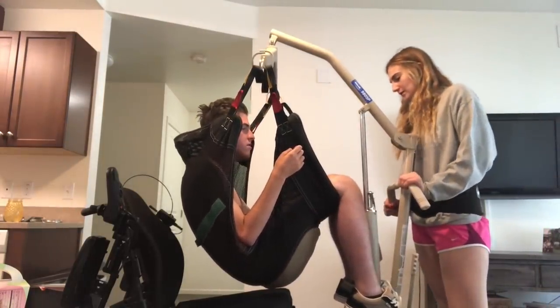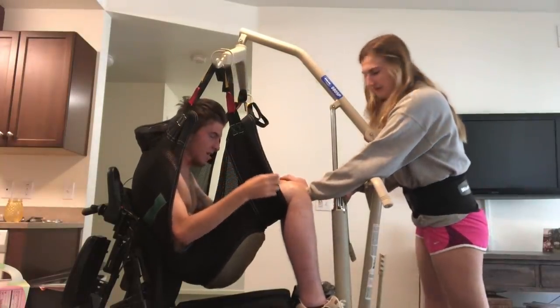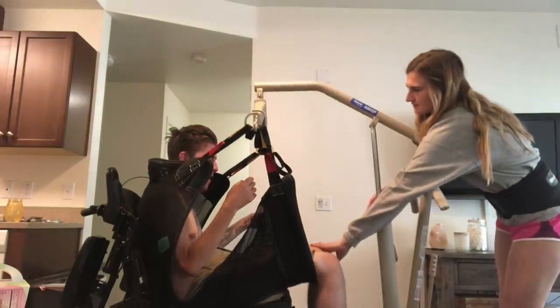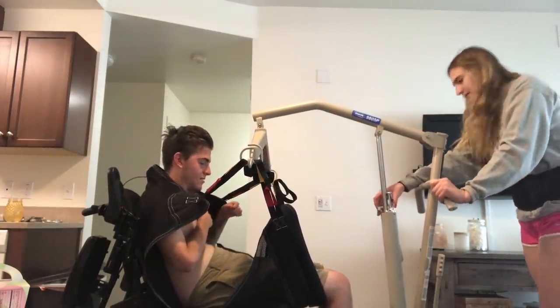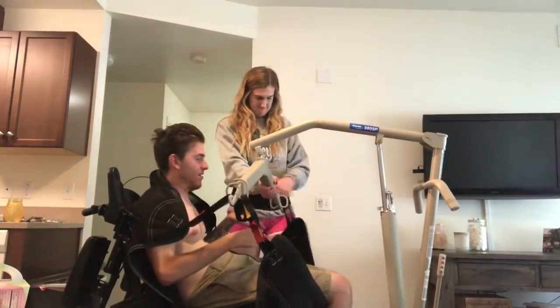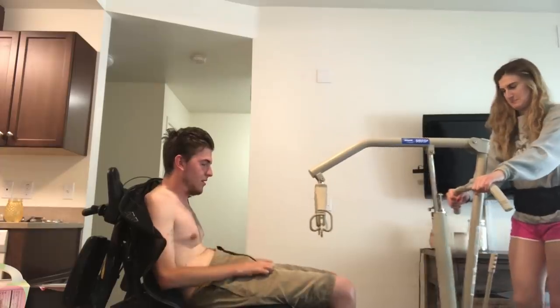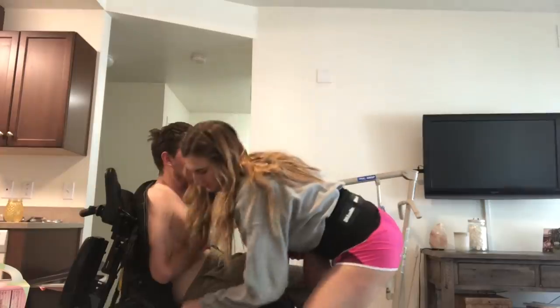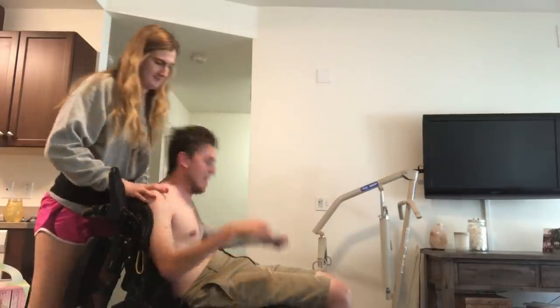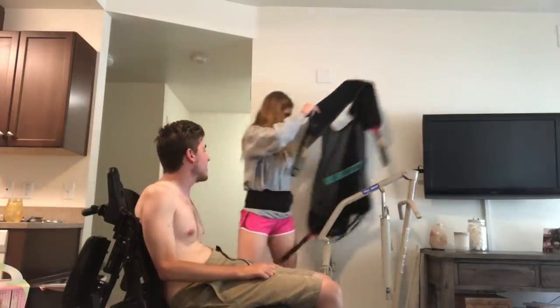Now I'm just going to push his knees back, and then with some minor difficulties, push his knee back and then open the lever slowly so I can keep continually pushing him back. He's good. You are on it really well today — that was a good one. Sometimes I'm on the edge of my seat and we have to lift you back up and push you back farther. Perfect. So I'm going to do the opposite of last night: lift the leg up and then push it back. We're done — that slid off pretty good too.